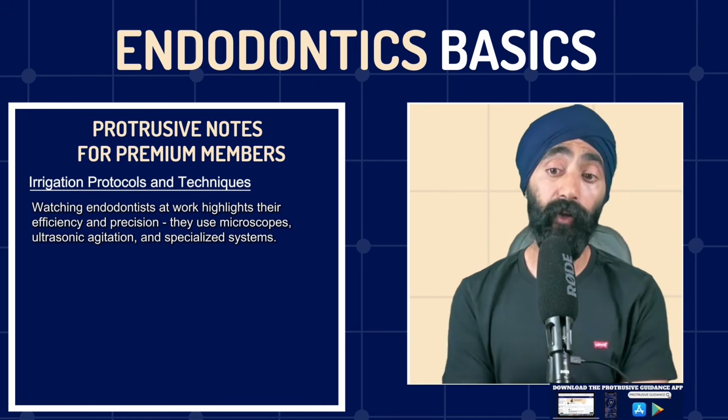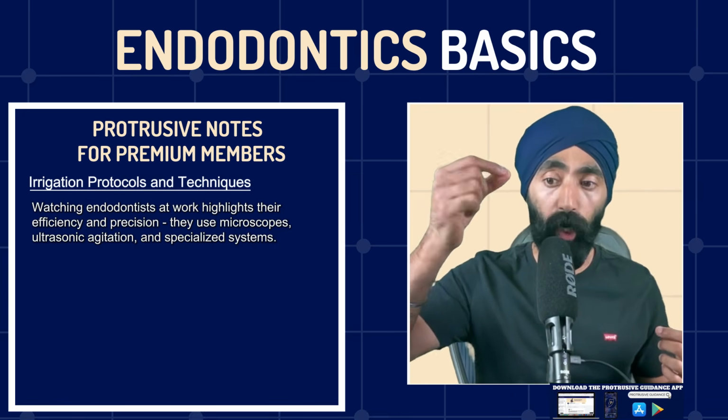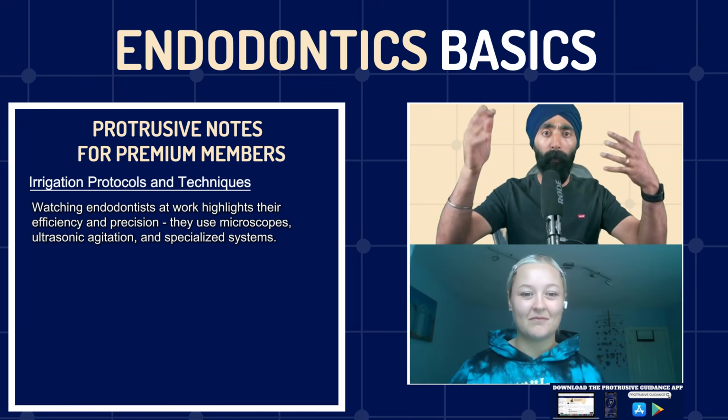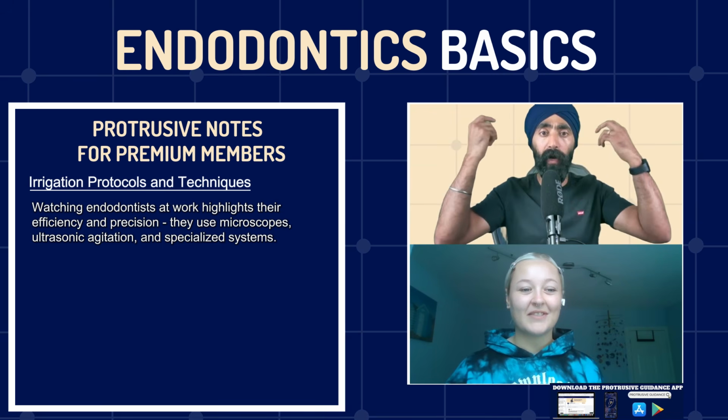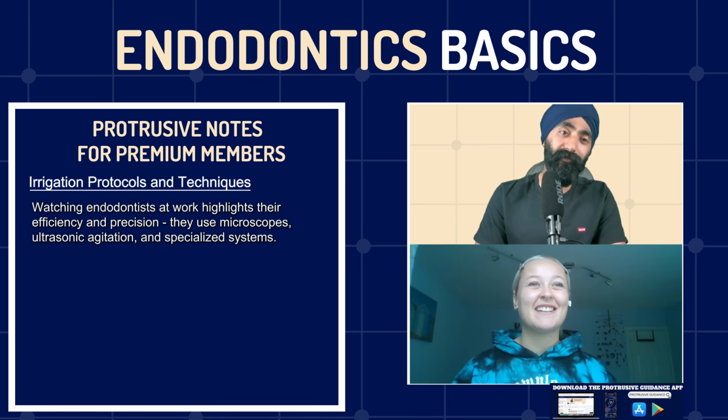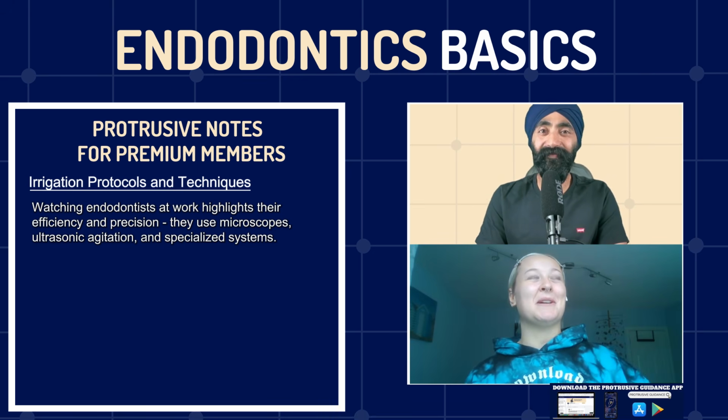But yeah, they use this almost gold colored ultrasonic tip. They dip it into the canal. They switch it on, and you see the bubbles form, and then suddenly it goes murky, and then it goes clear. It's beautiful. Yeah, and we've got, I think he's an endodontic specialist.